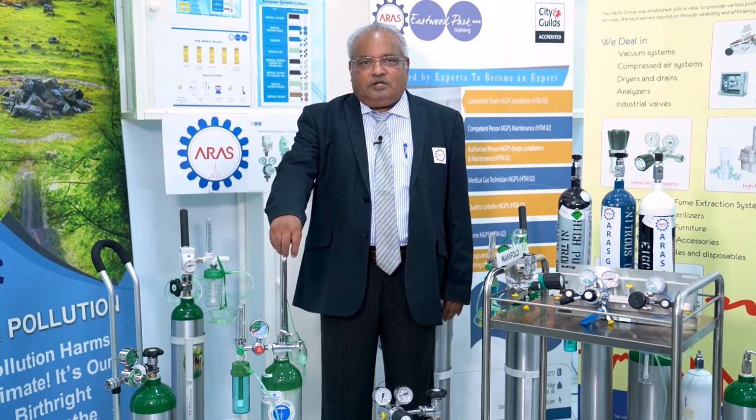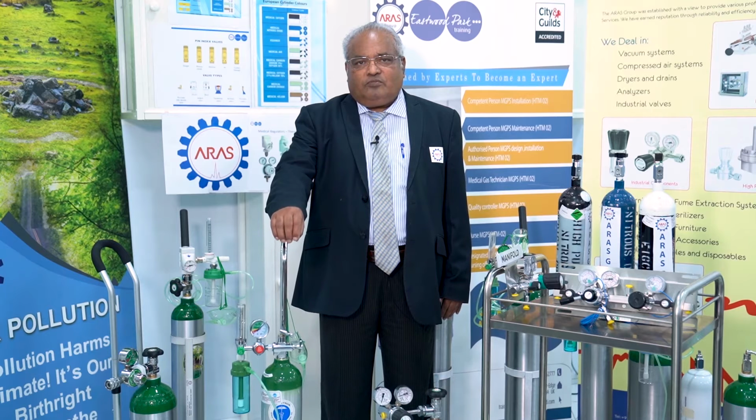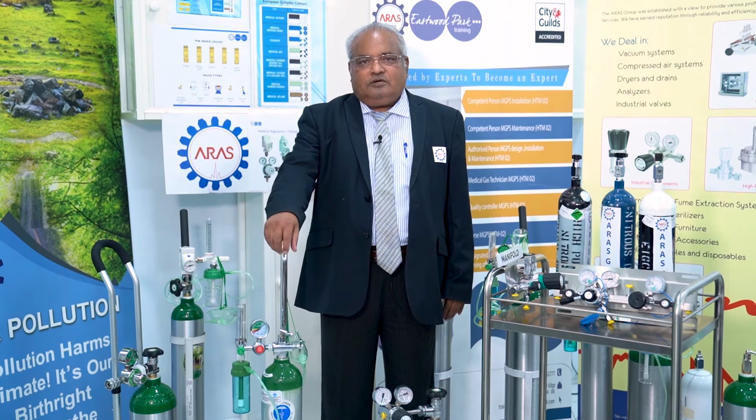Then we are talking about regulation. A single stage regulator is already preset for oxygen use, at less than 4 bar, so the pressure is very constant. Then you use a flow regulating valve with flow meters.